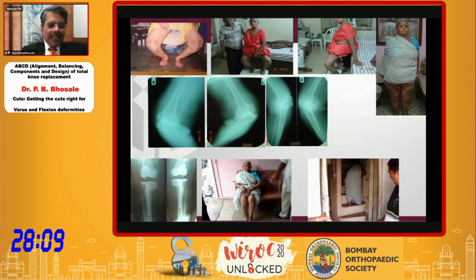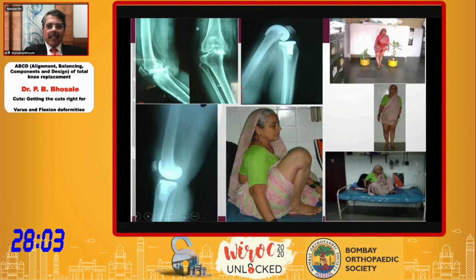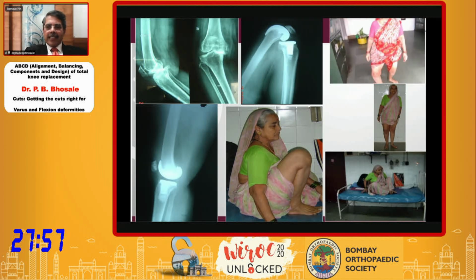And this is a severe deformity. Everything can be done with the manual, and in some patients you do get flexion if you arrange everything, not every patient.